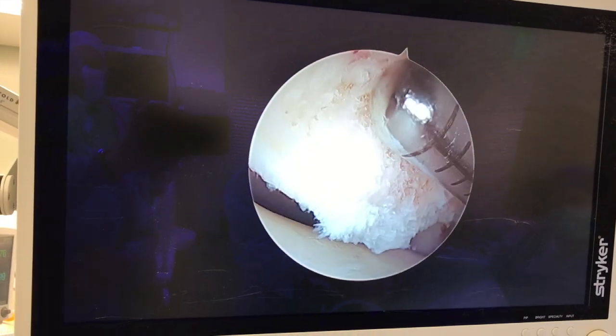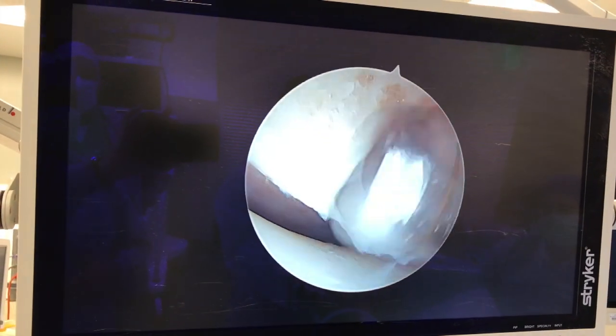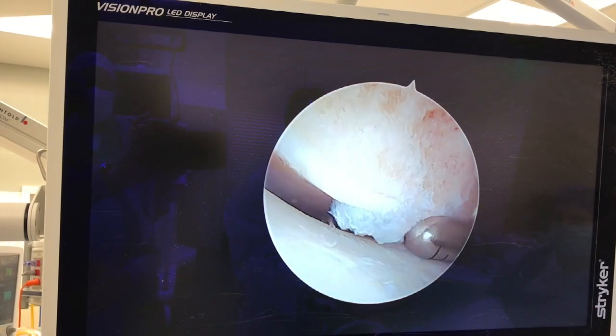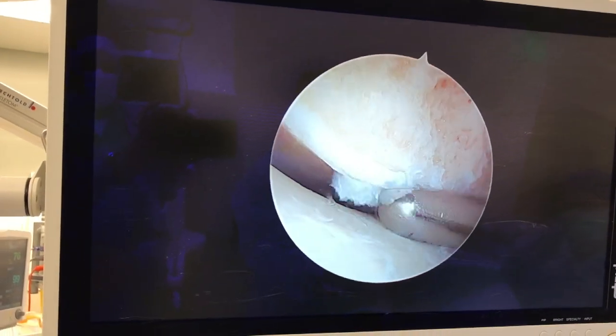With this device, we turn on and kind of go after this bone here. You can see the device eats right through it. And then when I need to trim the cartilage, it also takes care of that too at the base. It's kind of an all-in-one device.